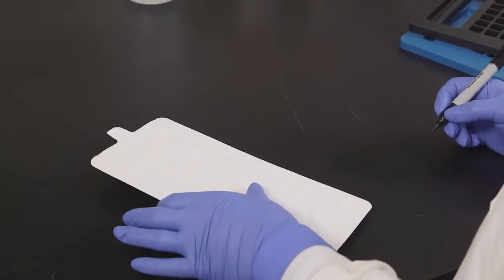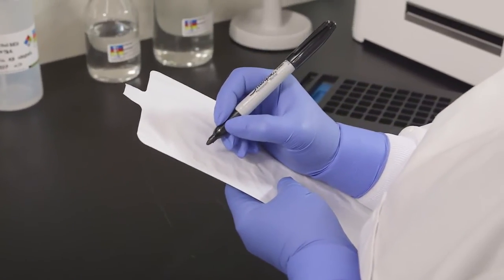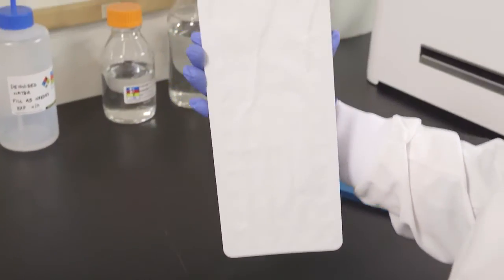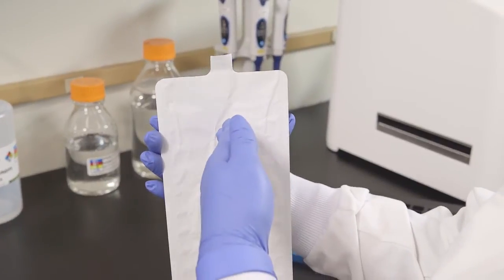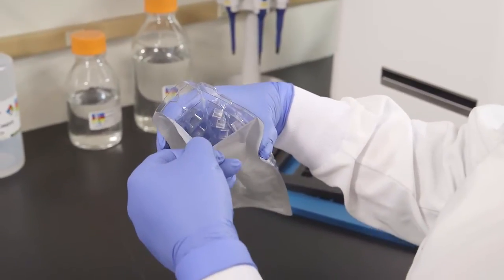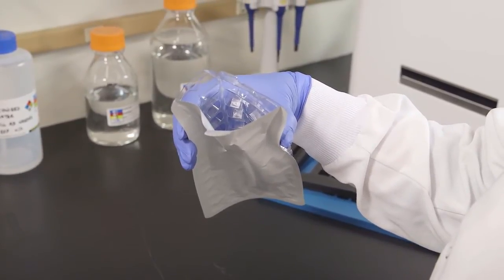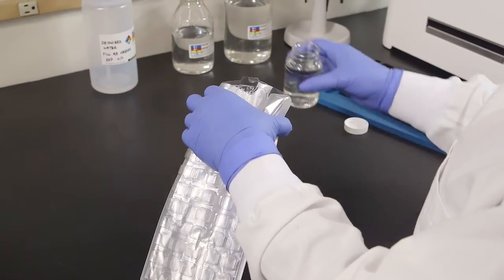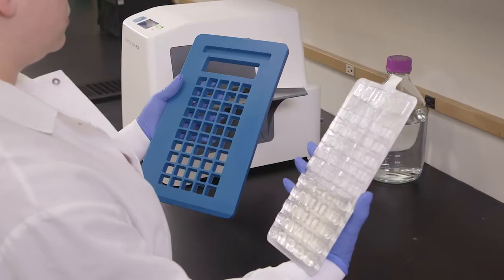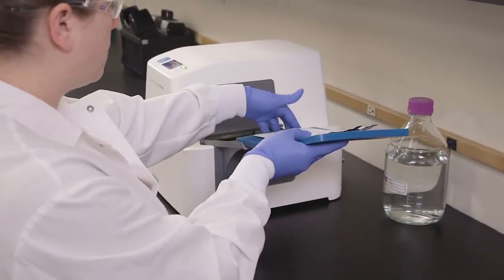Use only a permanent felt tip marker to label the QuantaTray. Adhesive labels may adhere to the sealer roller and ballpoint pens may puncture the paper. Hold the QuantaTray at the top with the well side facing your palm. Push the top edge of the QuantaTray in with your free hand while squeezing the tray into a circle. Open the QuantaTray by gently pulling the foil tab away from the plastic side — be careful not to tear the tab. Do not touch the inside of the tray. Pour the sample mixture into the QuantaTray, avoiding contact with the foil tab. Place the filled QuantaTray on the rubber insert, making sure each well fits its corresponding hole.